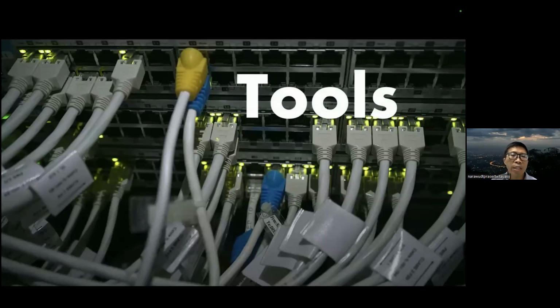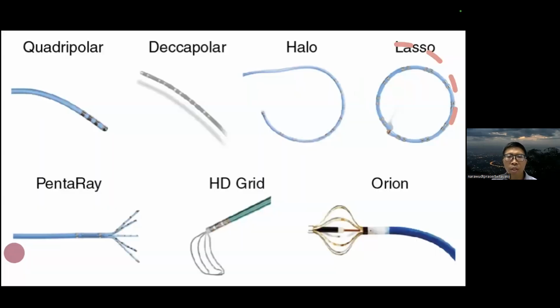And we need some tools. Those tools are catheters, specific wires that can be placed in your heart through your groins or other veins.